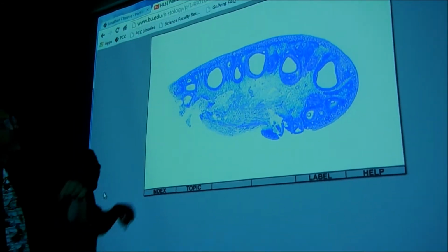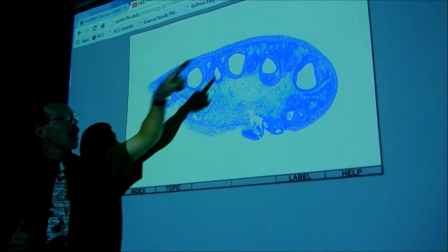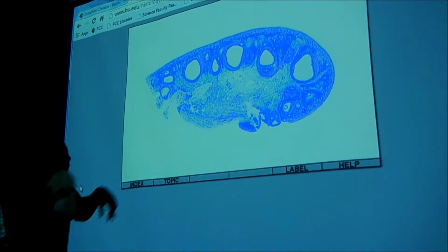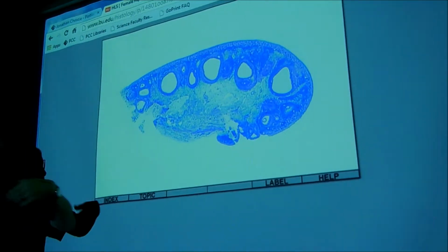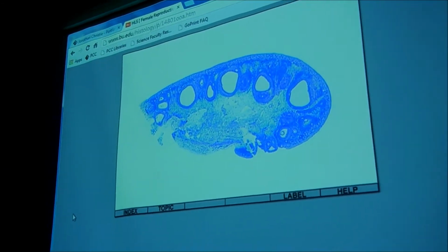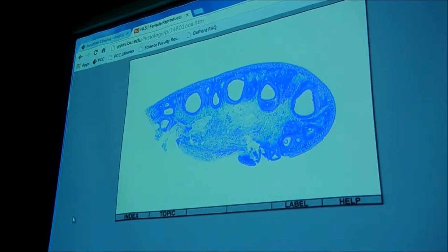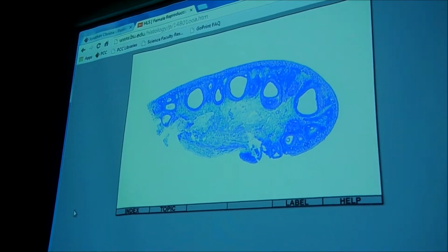Very good. If I pointed, you'd have to zoom in on a slide, but point to the ones that are a little bigger, more round. Which follicle are those? Primary. And what oocyte are they? Primary. Yay. I point to the ones that look like eyeballs. Here and there. There's one down here. The next step up, here's one. They are secondary follicles with primary oocytes. Very good. Point to the big circles. Those are going to be mature follicles, or Graafian, or vesicular, with secondary oocytes. Yay! If you get that, you can do pretty well.